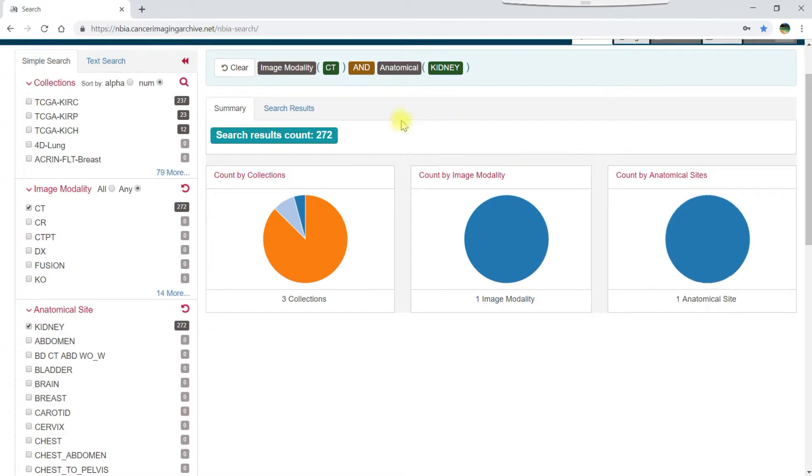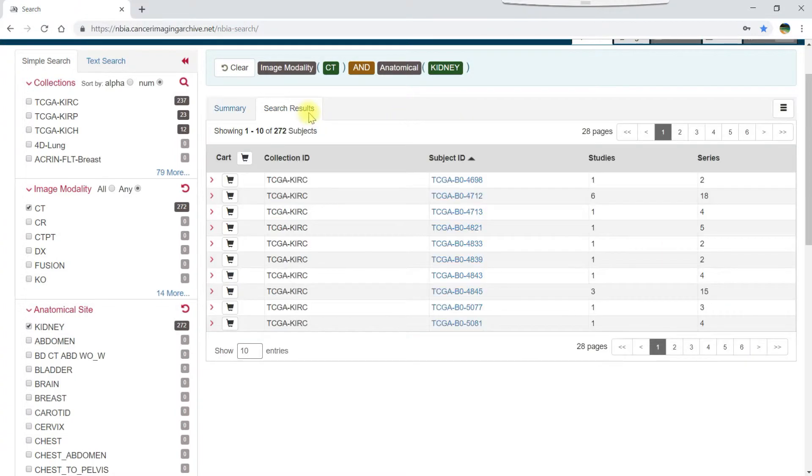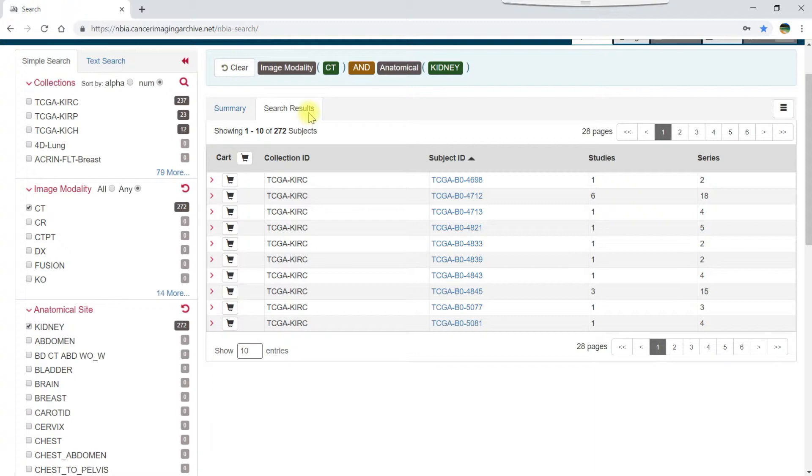You can also click the search results tab to dive deeper into the data, add the data to your cart, and then download the data, which are tasks described in separate videos that are mentioned in this video's description.